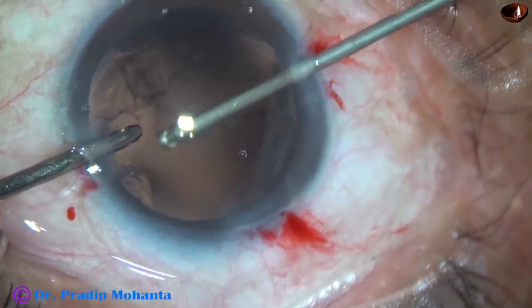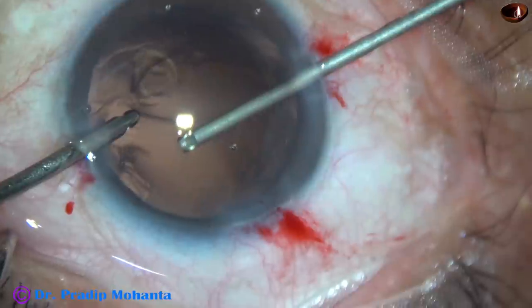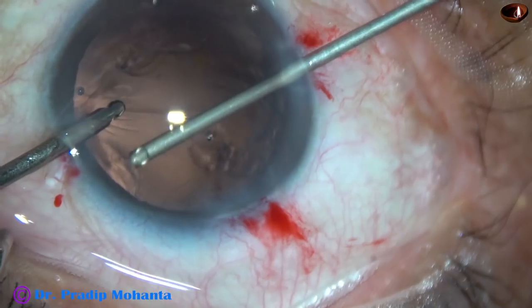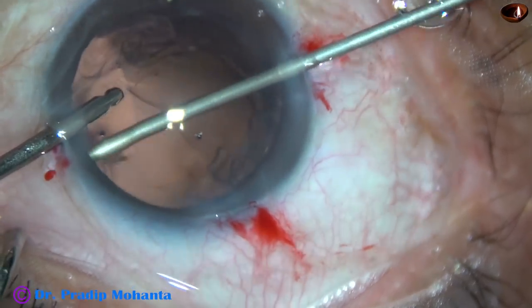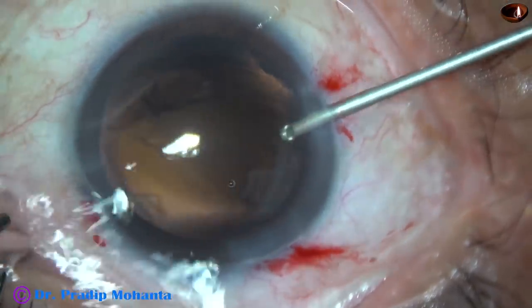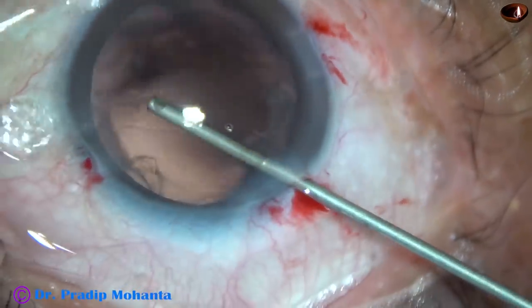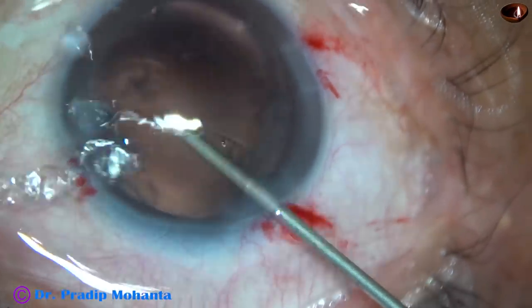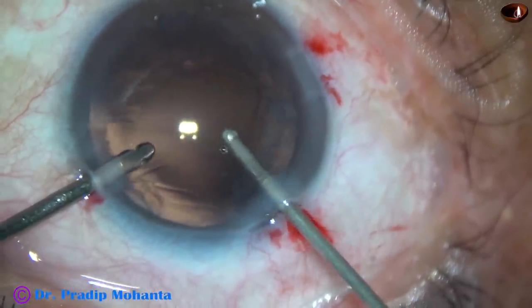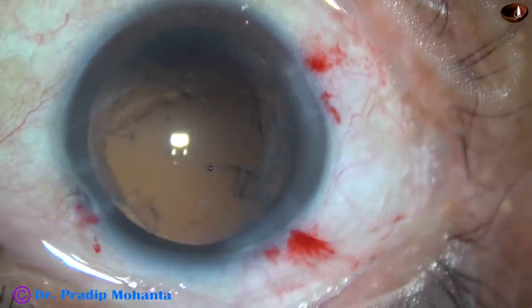I didn't realize this at this stage. I thought I had done a nice vitrectomy. The vitrectomy part is almost unedited, so you can see each and every step, a little fast-forwarded. This surgery took 25 minutes. I have reduced the time by 10 minutes, but I tried to show all the steps.